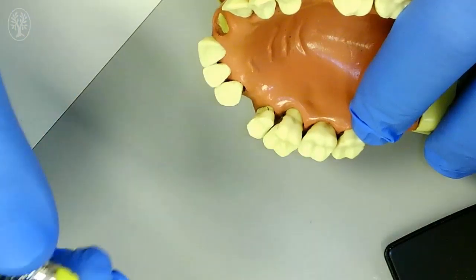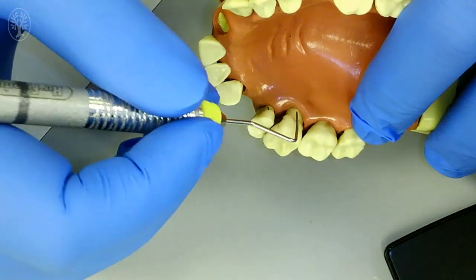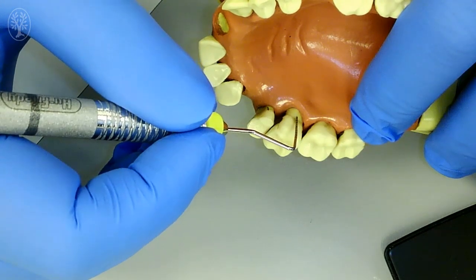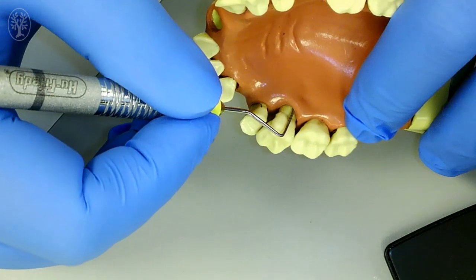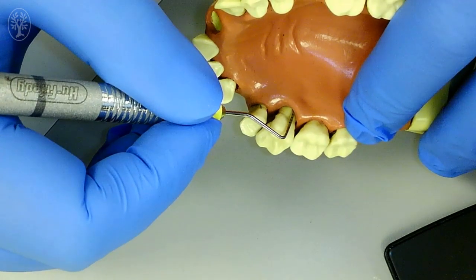Let's repeat this measurement at the distal palatal line angle. First, find the cement-enamel junction and insert the probe to the sulcus. The clinical attachment level here is 8 mm.